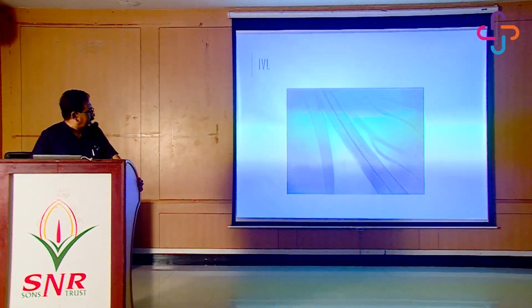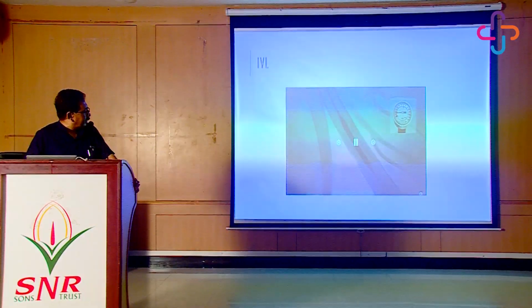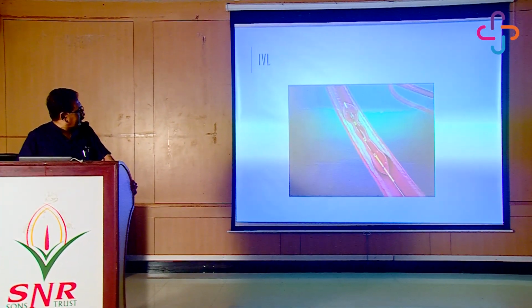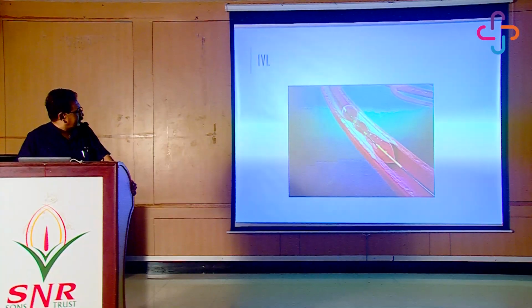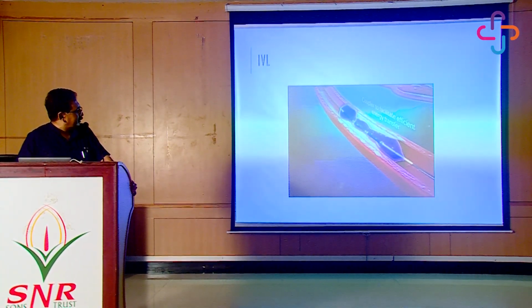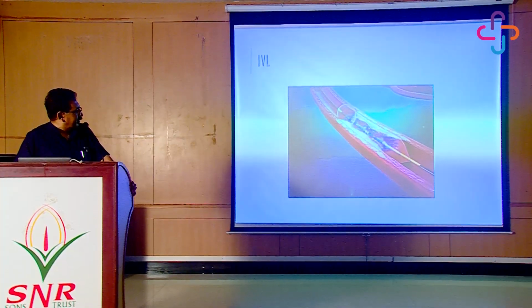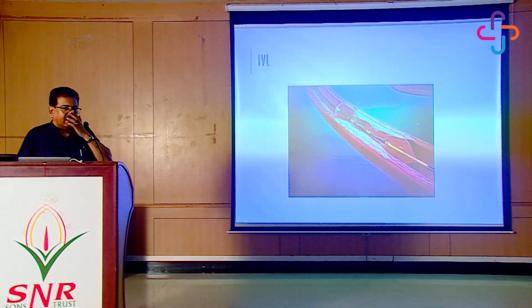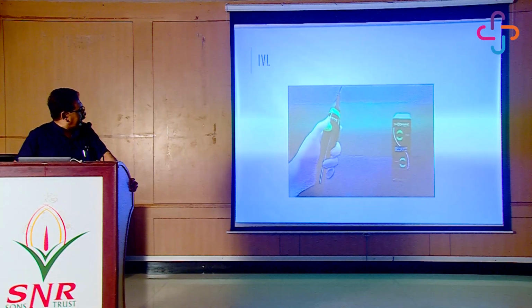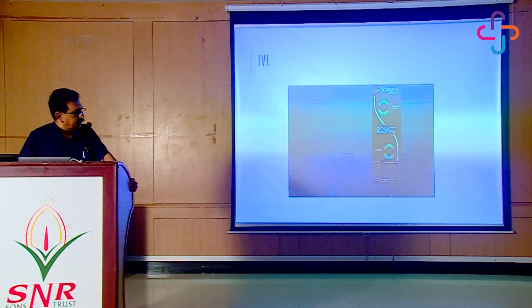So this balloon helps to... You can see here the sonic waves create about 50 to 100 atmospheres of pressure, and it's able to crack and break the calcium.